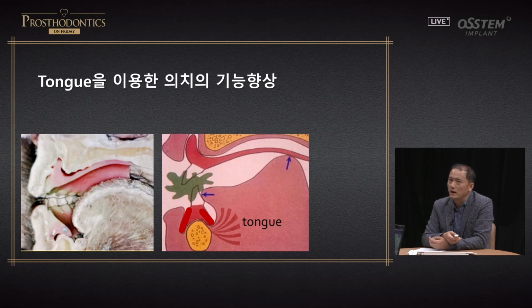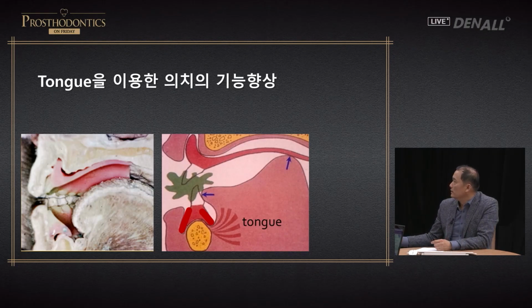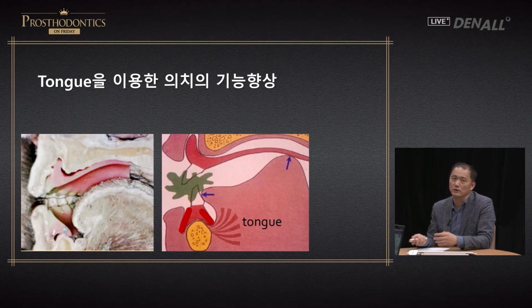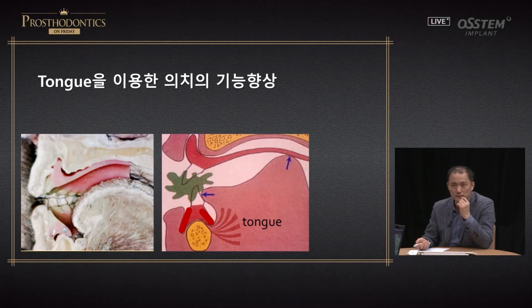Another thing is that if you use a denture and the tongue tip pushes down on the anterior side, it would be good. But that sometimes does not happen. So you have to train the patient. You have the anterior teeth to use for chewing, and sometimes they mostly use the premolars. It's like, you know, having a tomato or peanuts, they use the premolars on the backside.